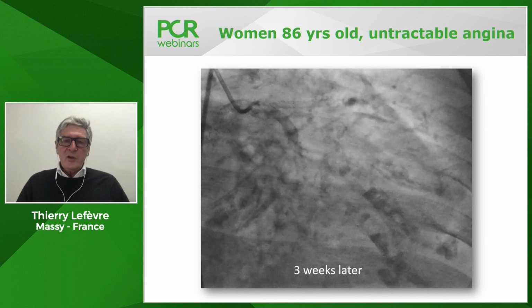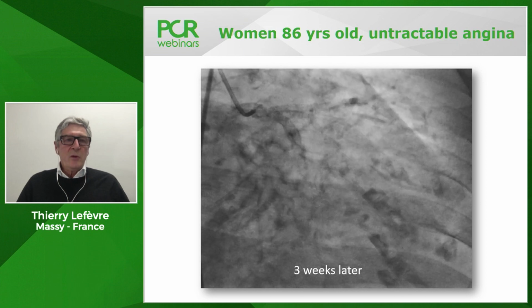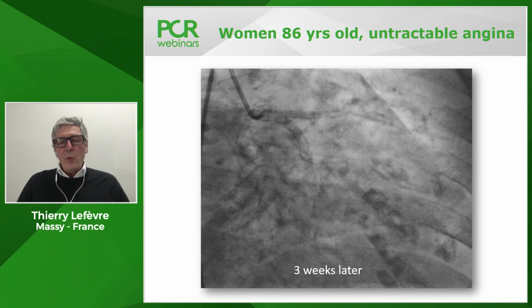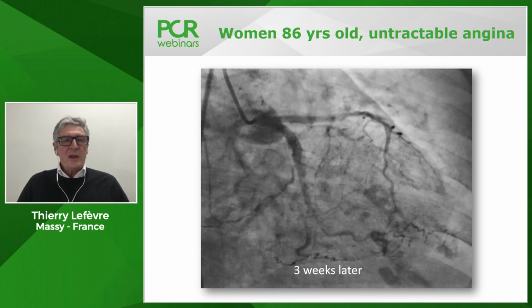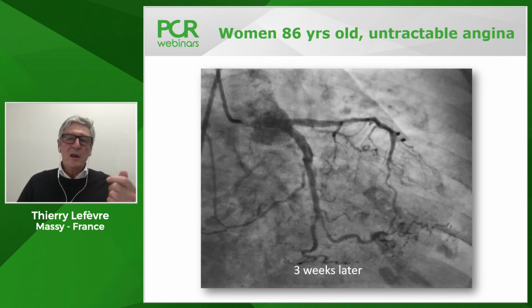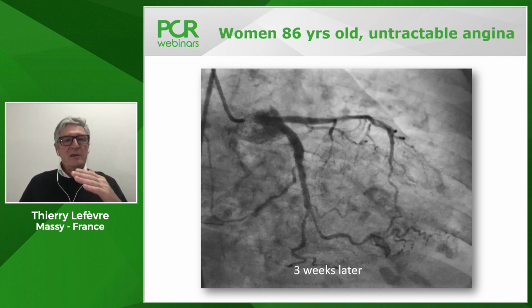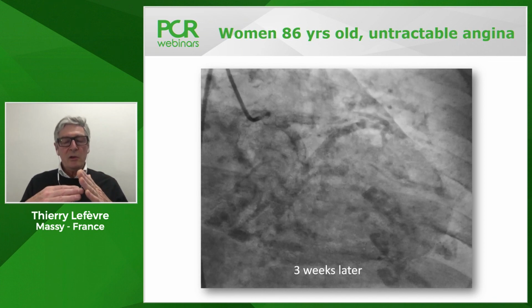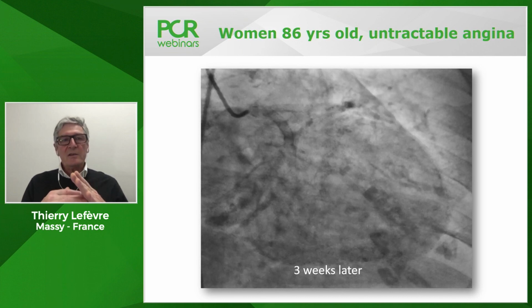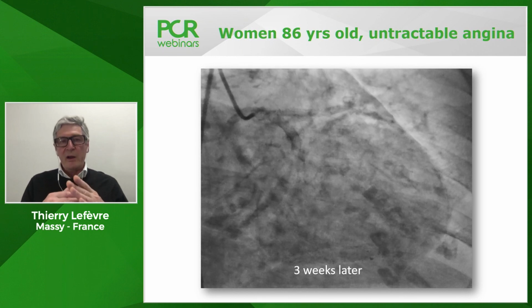And the last point is that if you have any doubt about the positioning, of course you can do a TAP. But there is a very nice way to position: you put the stent at the right place, where you think it's the right place because you have a good view to see it. And then you inflate the balloon in the main branch. If you are in a good position, you see that the stent is exactly in contact with the balloon that you have in the other branch and at the level of the carina.